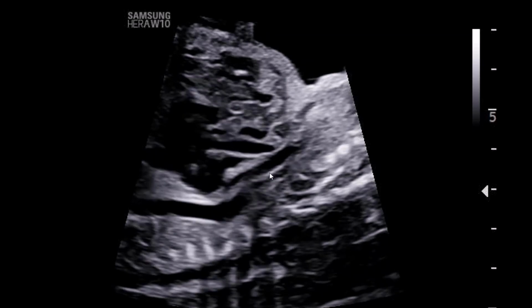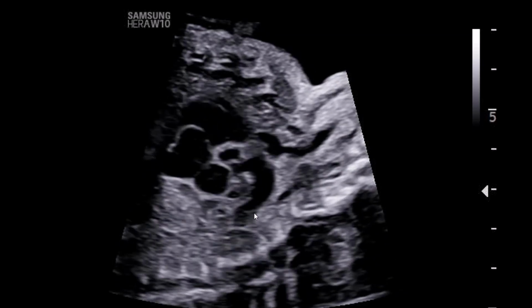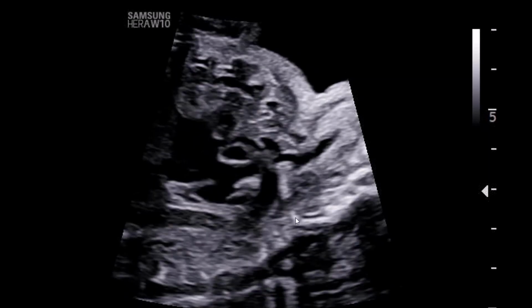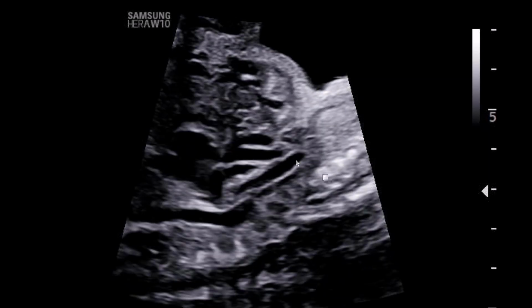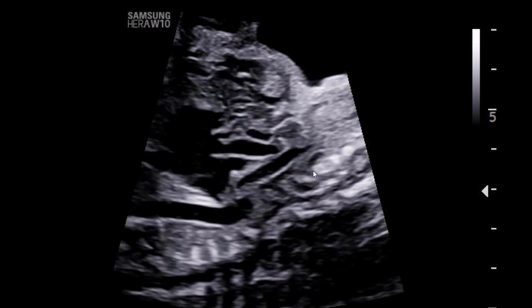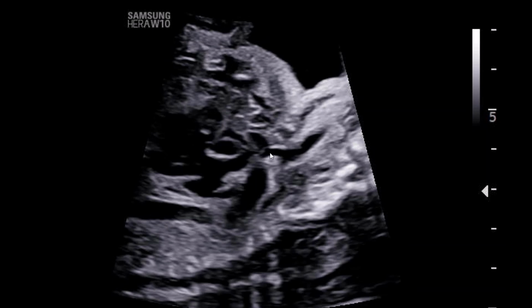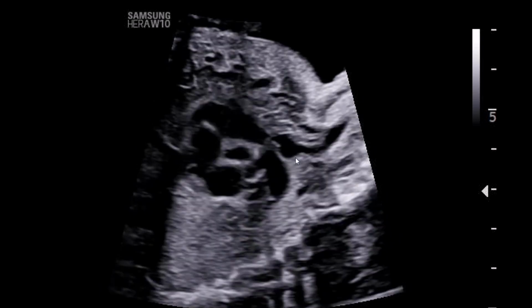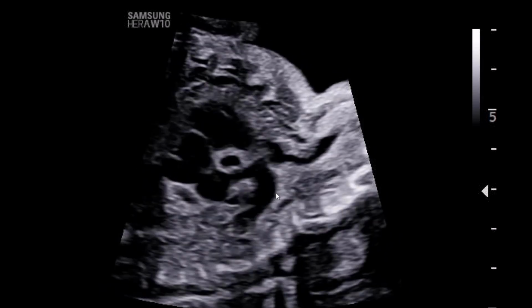Again, that's the trachea there. And so this is important because this is one of the main views, the key view to prove or disprove interruption of the aortic arch. The ascending aorta is significantly hypoplastic, and if we saw a transverse aortic arch, I would suspect it would be also significantly hypoplastic with a coarctation, but we're not even seeing a connection of that ascending aorta or arch with the ductal arch.